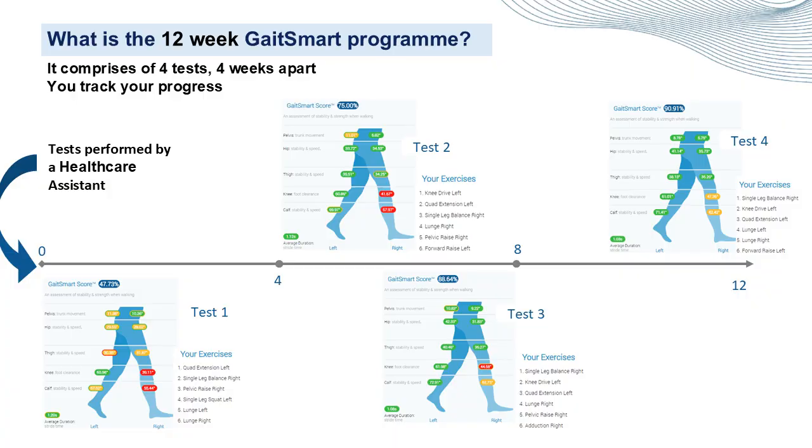This gives an example of somebody improving. So we have the first test. In this case, you can see it's the right knee that's an issue. But everything else is weak, because once you can't walk properly, all your muscles will reduce. And then we go, second test. The other muscles are starting to work.